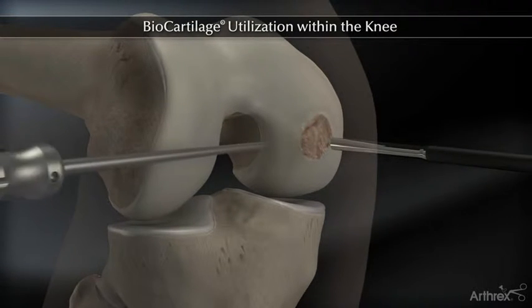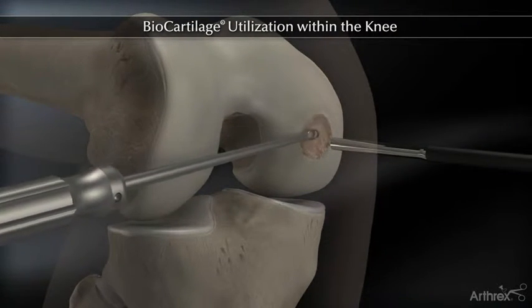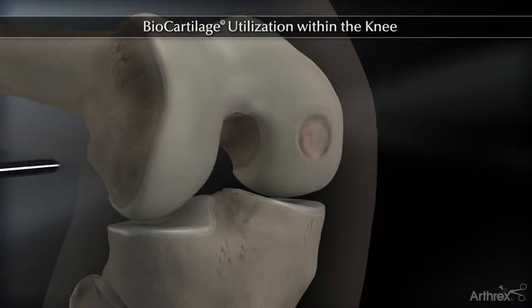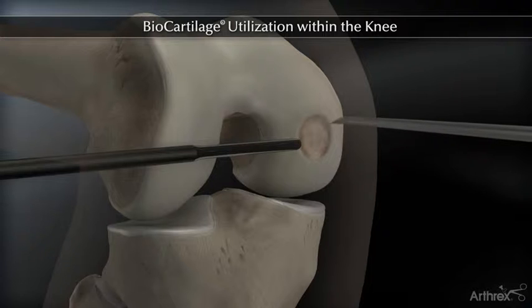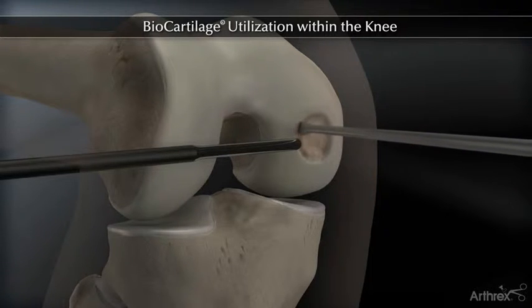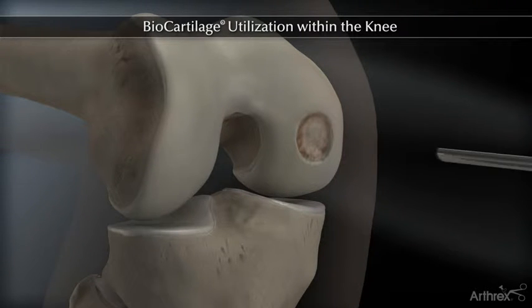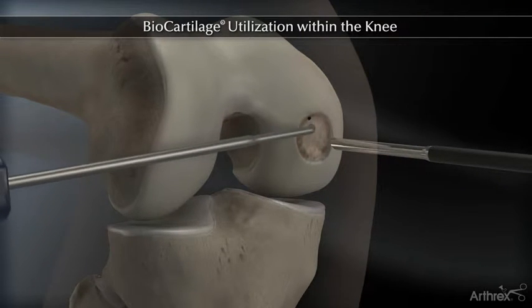Before implementation, debride the defect, remove the calcified cartilage layer, and establish a stable perpendicular margin. Utilize PowerPick to create bone marrow access channels to complete the microfracture procedure.